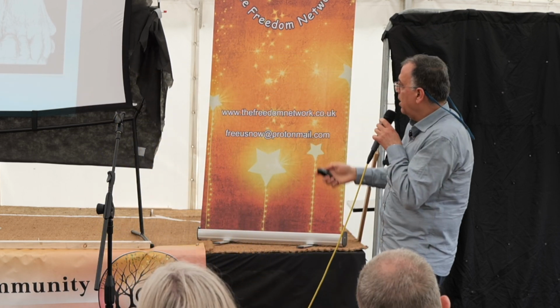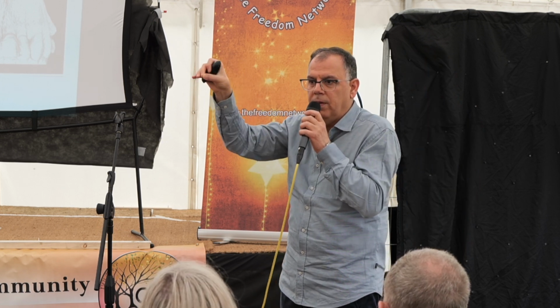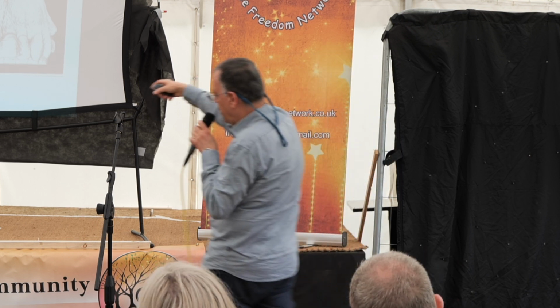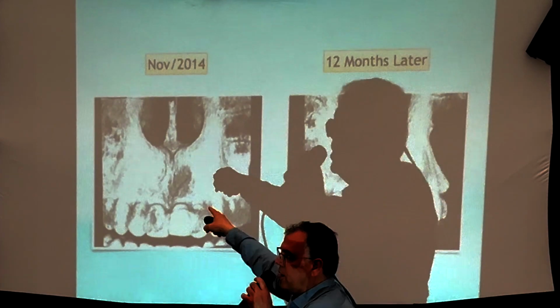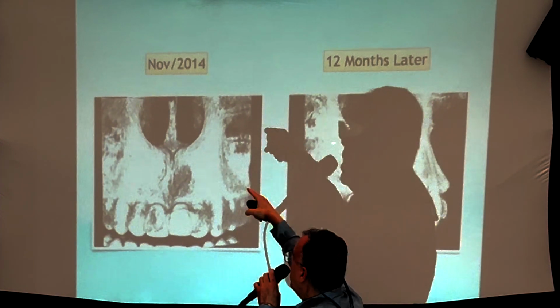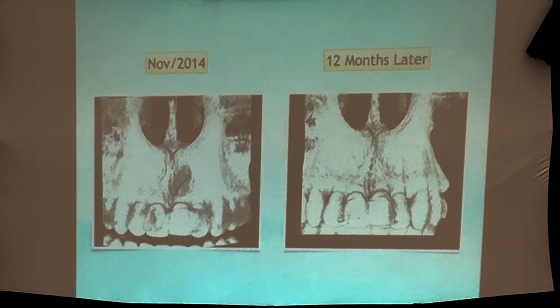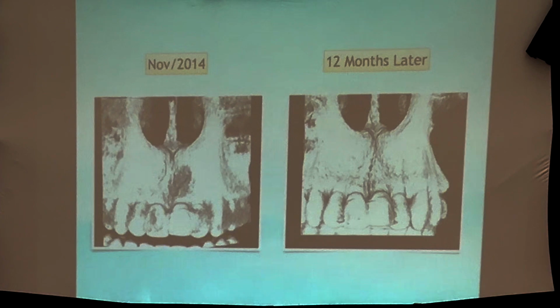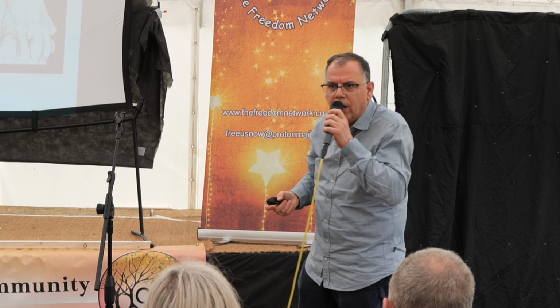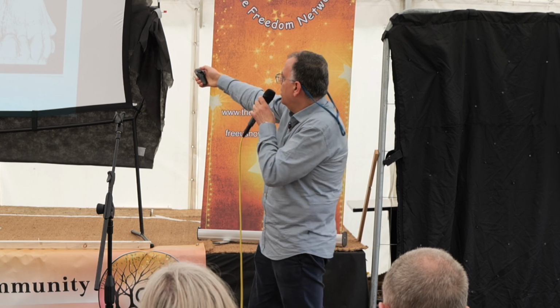And I did not do anything other than perforating the soft tissue with my laser tip, going immediately to the cyst here. You know what a cyst means, the lesion, the infection, bombarded with laser. And 12 months later he came back. Again, I lost him. Where have you been? Why are you not coming to follow the case? I'm fine. Nothing wrong here. I'm very well. Let me have an x-ray. I sent him back to the CBCT scan. And that was the case.